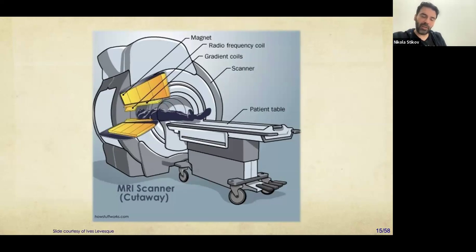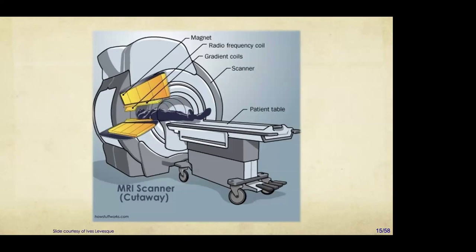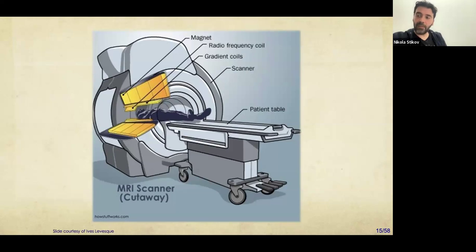Do you know how we do it? How we get to temperatures that low? I think helium is used? Yeah, we use helium. And helium is in short supply, so we're running out of helium on Earth, so scanners have gotten more and more efficient with the helium so that it doesn't boil over.